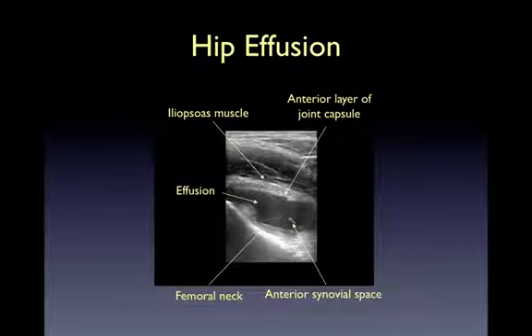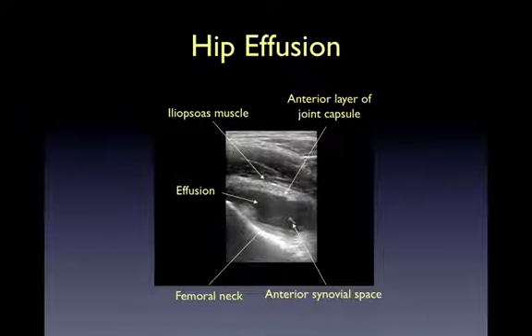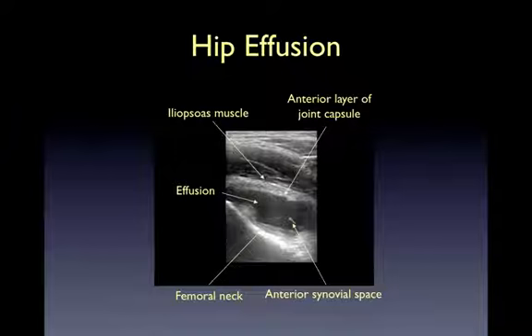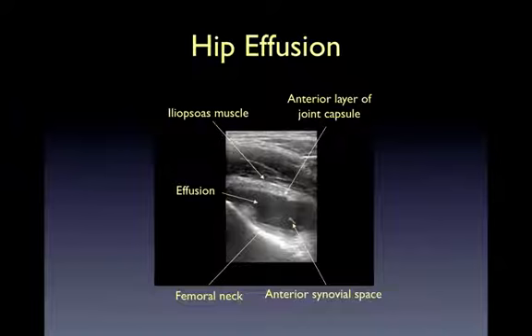This image shows an abnormal hip in a seven-year-old child. Let's review the labeled structures starting with the word 'effusion' at the left-hand side of the image and proceeding clockwise. A very obvious hypoechoic effusion is present. At top left, the iliopsoas muscle is labeled. Just beneath the iliopsoas muscle, the anterior layer of the joint capsule is seen — this structure is easier to identify in the presence of an effusion. At the bottom right, the anterior synovial space is labeled. At the bottom left, the hyperechoic femoral neck is labeled. The femoral head and growth plate are not seen in this image as they are out of view at screen left.